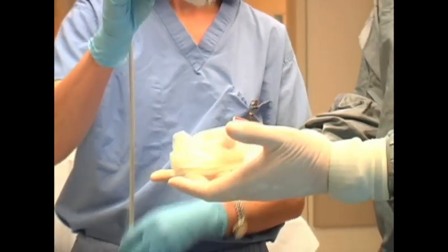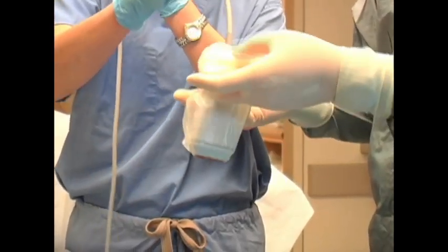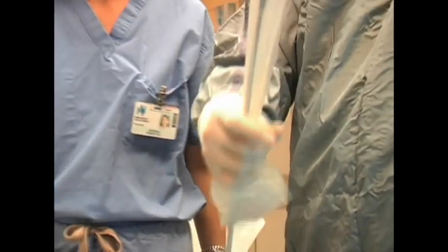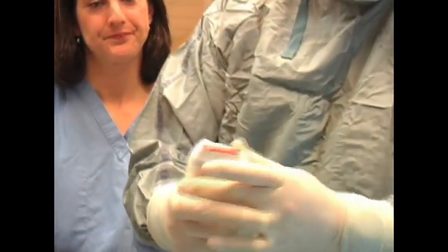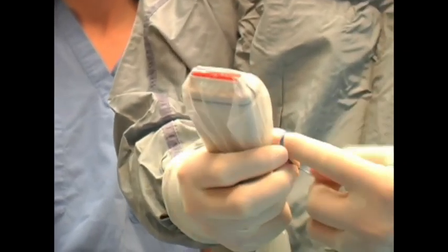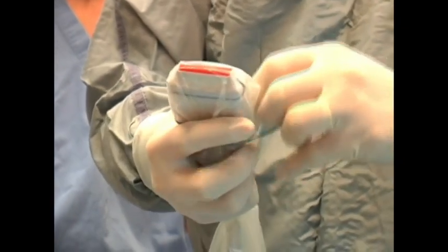Dan has folded up the sleeve much like a sock, and now Jessica drops the transducer into the sleeve. Dan smooths out the sleeve, and he stays sterile. He applies the rubber bands, one near the top of the transducer and one further down on the cord, to keep the transducer cord sterile.